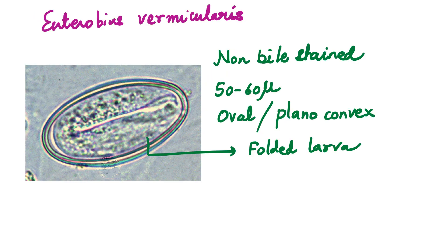Moving on to Enterobius, the pinworm, threadworm, or seat worm. Remember: the eggs are not seen in stool specimens because they are laid by the female worm on the perianal skin. So how do we demonstrate these eggs? By NIH swab or the scotch tape technique. These eggs are non-bile-stained, 50 to 60 microns in size, typical oval or sometimes plano-convex eggs, and you can see a folded larva inside — it is already larvated and infectious to man.